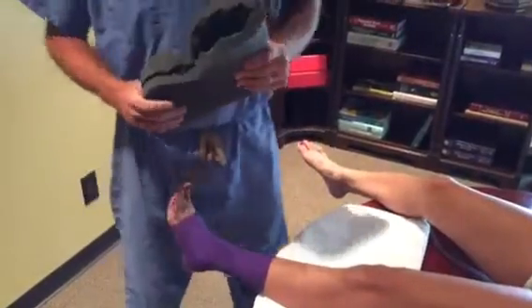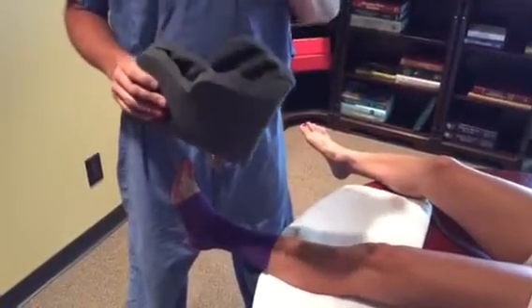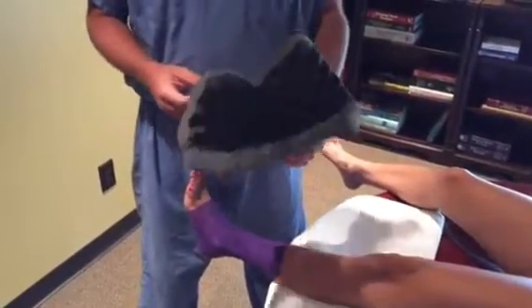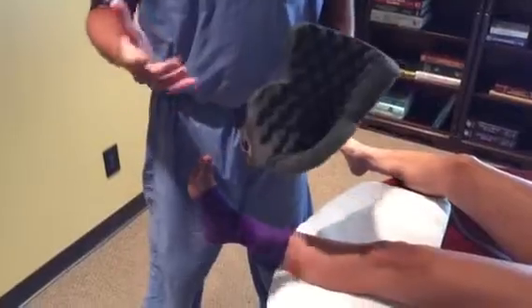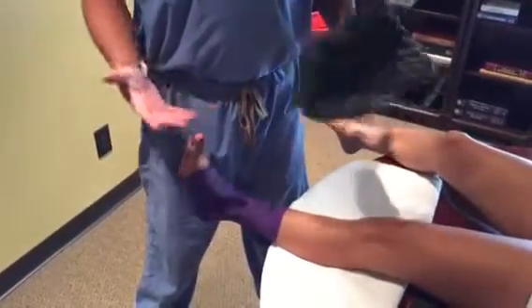Hello ladies and gentlemen, this is Billy. We are here today to demonstrate how to properly put on the boot liner, which you all have a sample of. This is going to be a technique that you will become familiar with, but the staff will do, obviously.